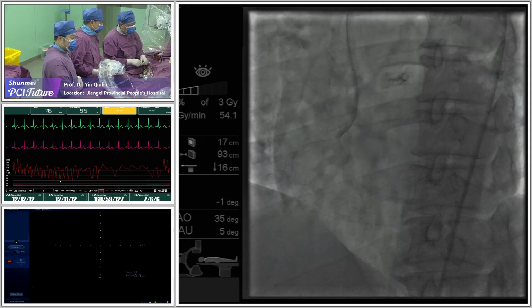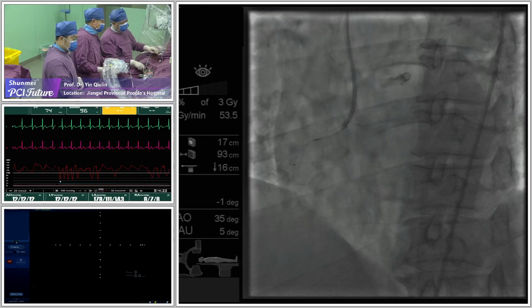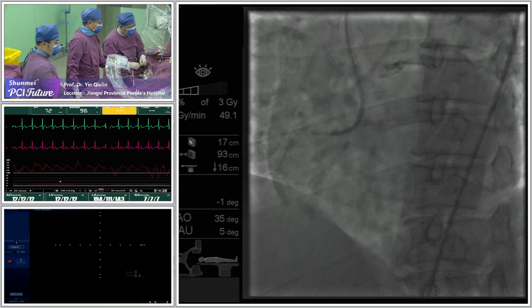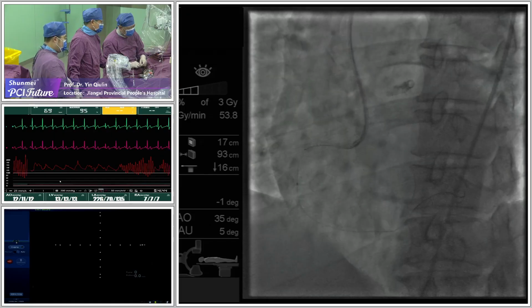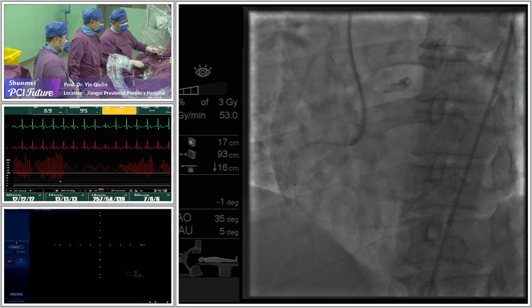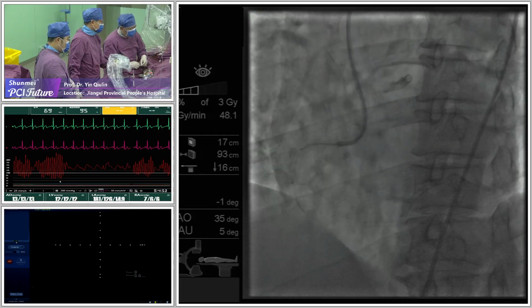Thank you for the introduction. Let's see the angio of today. We have 2 angios. So how about this case, Dr. Yang?